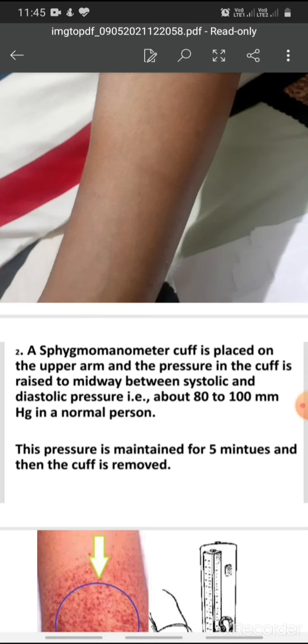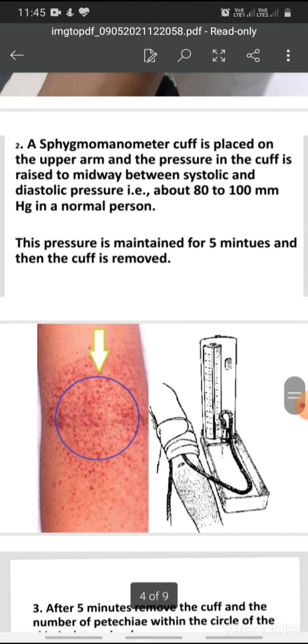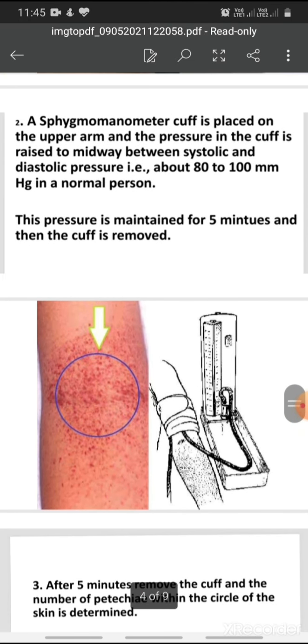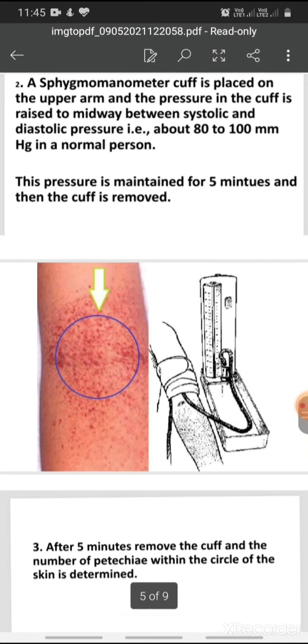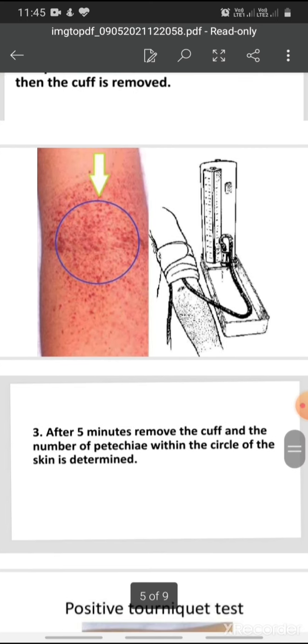This pressure is maintained for 5 minutes. After 5 minutes we have to remove the cuff. After 5 minutes, remove the cuff and the number of petechiae within the circle of the skin is determined.